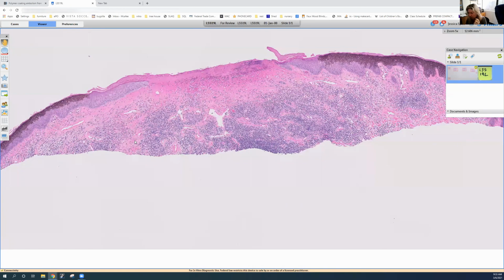Most arthropod bite reactions contain eosinophils, but not all. Mosquito and flea bites may show mainly neutrophils. A drug eruption can have this histologic appearance if it's been scratched. This is a punctum, but this could also be the long painted fingernail of somebody scratching. Persistent arthropod bite reactions, and this one is getting pretty cellular, can have a pseudolymphomatous look histologically.